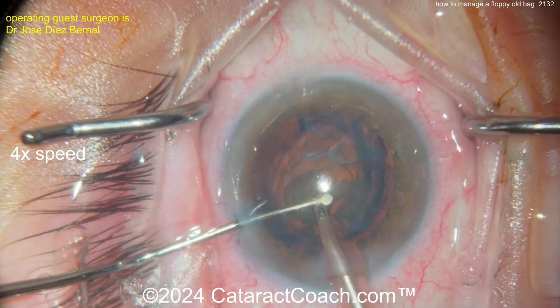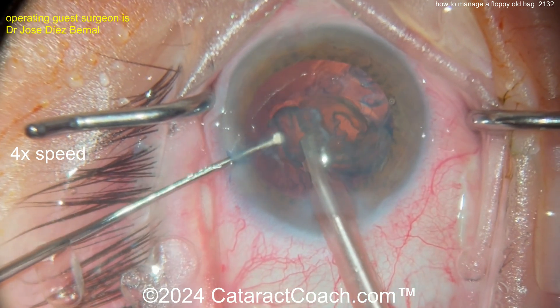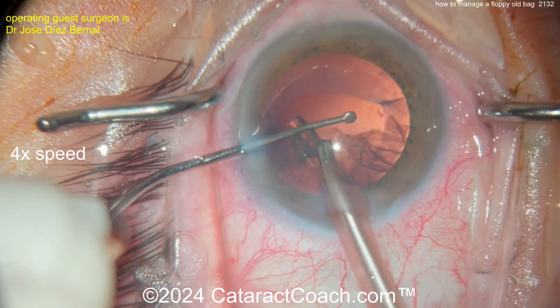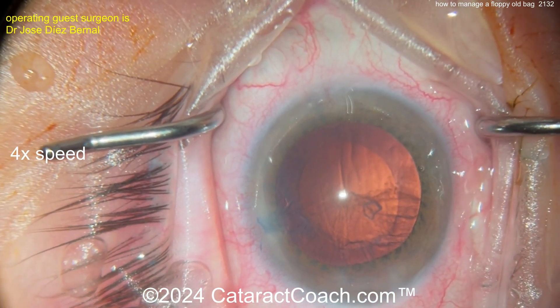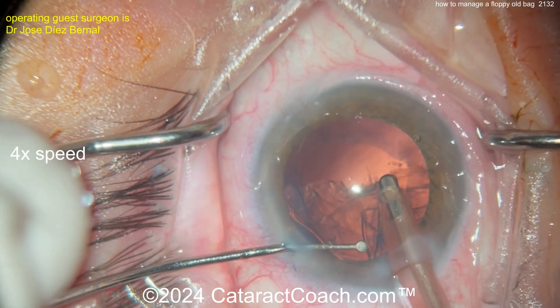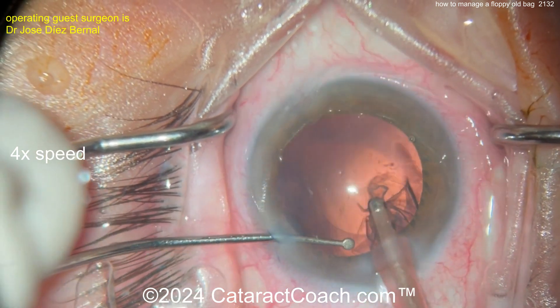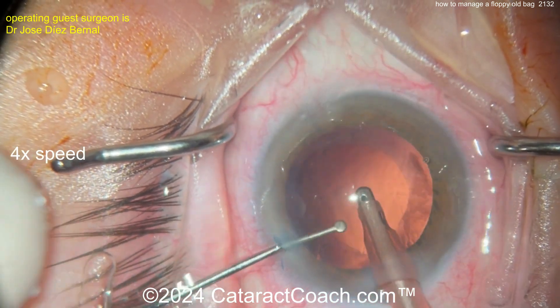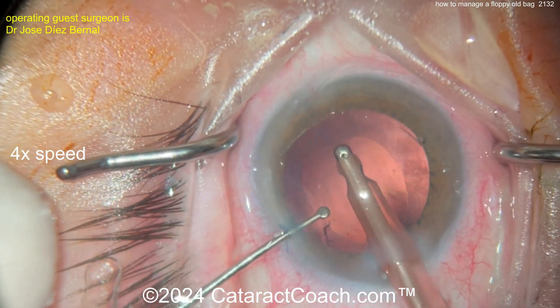In a case like this, what do you like for the IOL? I like a CTR — you probably guessed that. I also like a three-piece lens with the haptics in the sulcus and the optic captured through the rhexis; I find that really stabilizes things. Using the second instrument to prevent the bag from coming up is a very smart move. For cortex removal, be cautious — don't strip away zonulopathy support, just get the cortex out. Look at that — the rhexis is moving. You haven't seen the capsular bag equator much, which is a good sign, but look how much the rhexis has moved and how it's not round anymore.